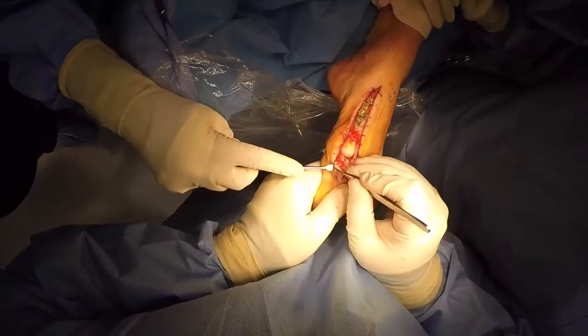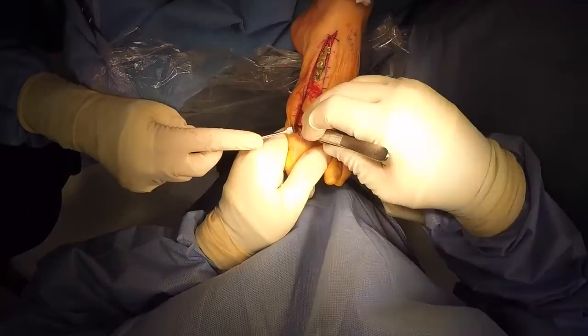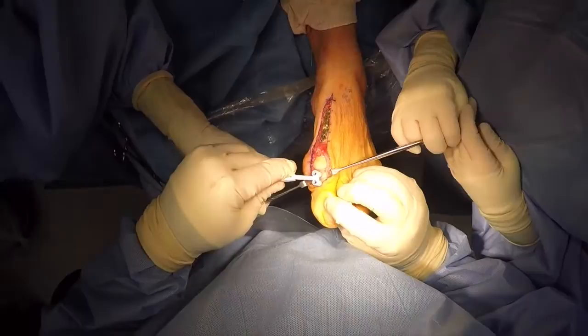Once we dissect out our wedge fragment, which often also comes out in pieces, a saw can be used again to gently feather the surfaces to oppose the cut surfaces of the bone, thereby completing the Akin procedure.